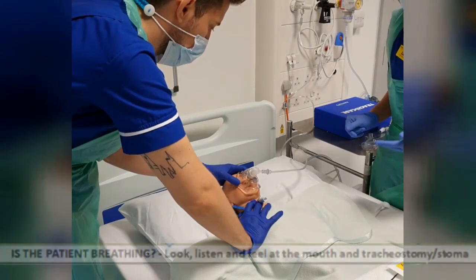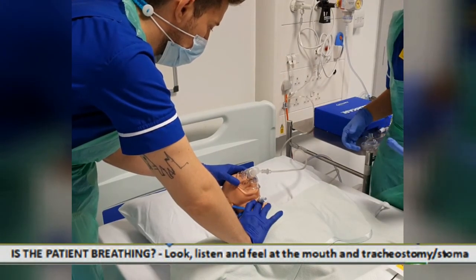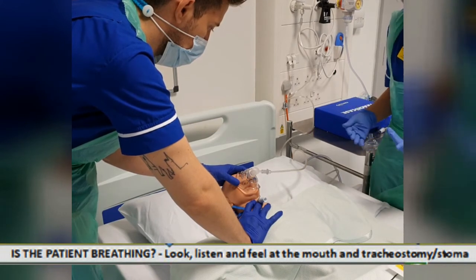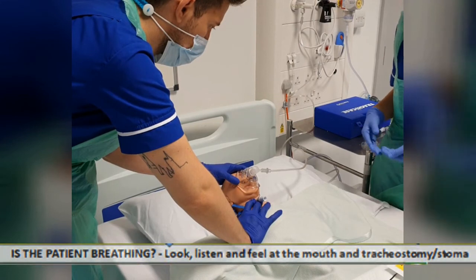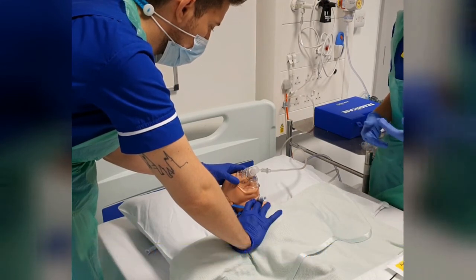So now we've got a new tube in, we're going to reassess our patient, continue administering some oxygen while we do that and get them nice and stable. Once we're happy with that, then we can secure the tube with some tapes.